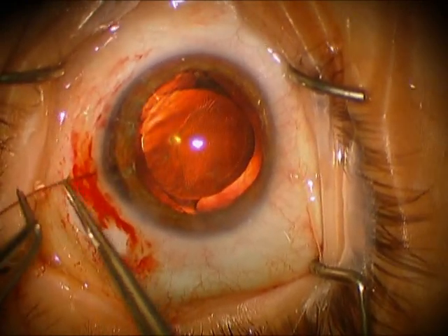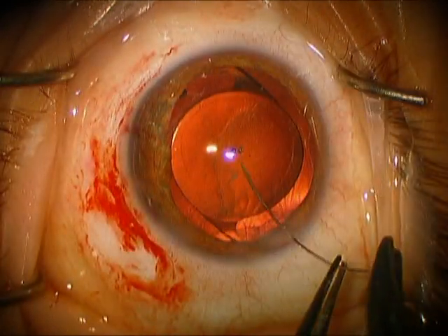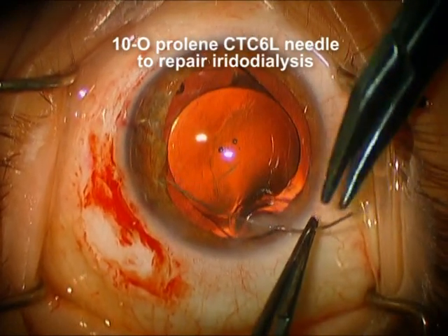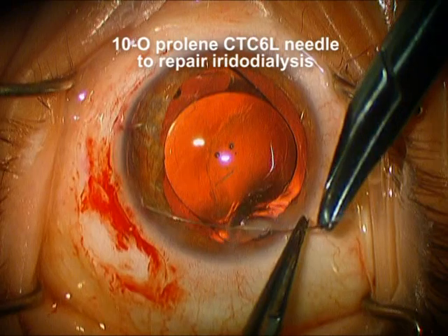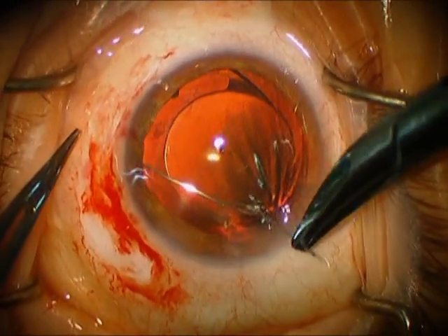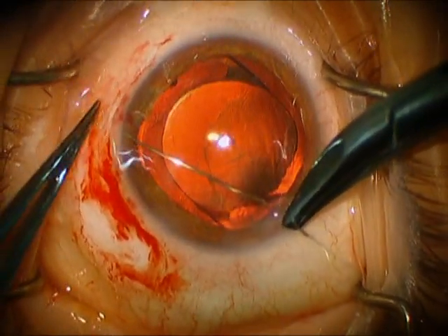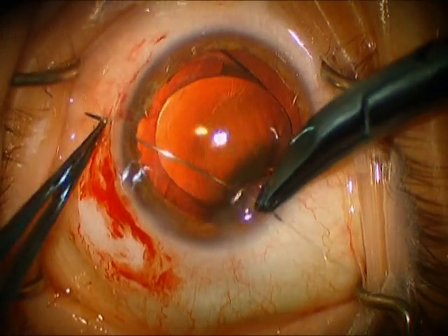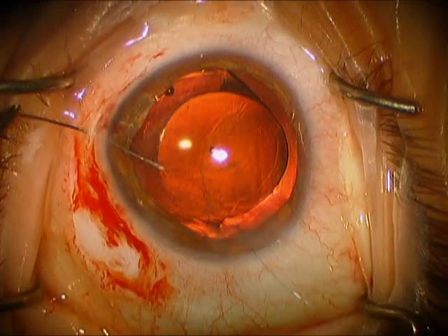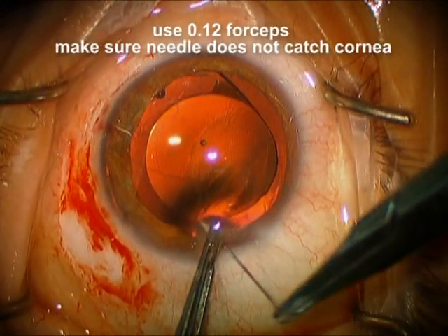We're removing this iris hook, and now we're going to repair the iridodialysis. We're going to use two 10-O prolene sutures. We're using this long curved needle, and what we're going to try to do is pass this through the incision that we used for the phaco without catching any corneal tissue. We're going to catch just a little bit of the most peripheral iris, and then we're going to come through the sclera here, about a millimeter or so back from the limbus. We've got to be very careful as we place this second pass with the other needle that we do not catch any corneal tissue.